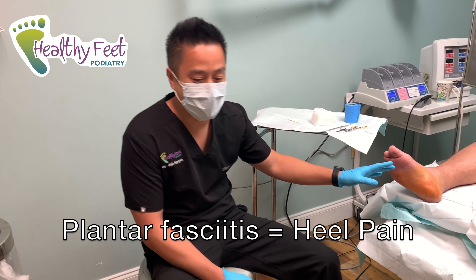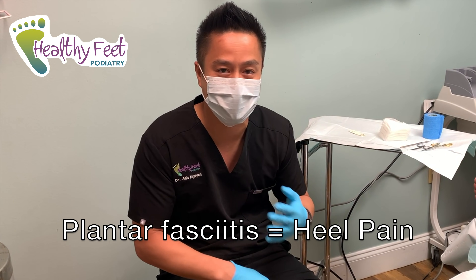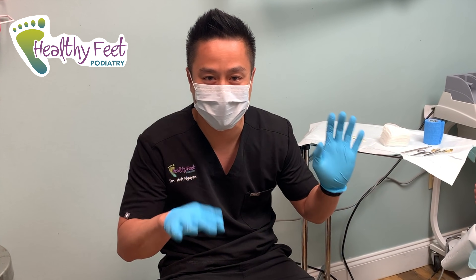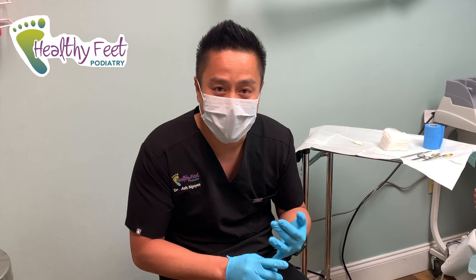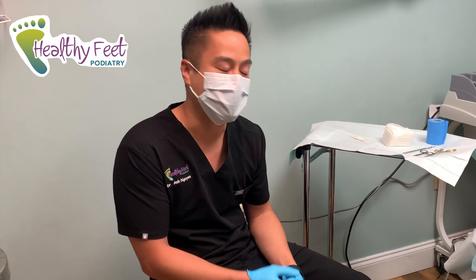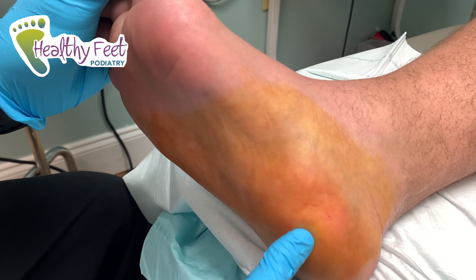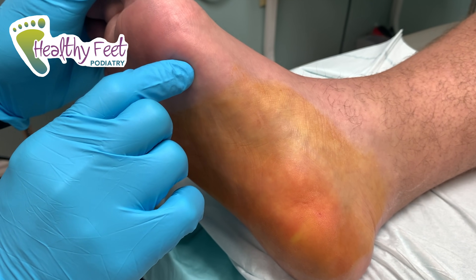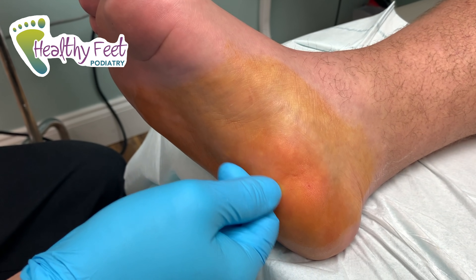Our patient here has plantar fasciitis and has tried everything — injections, stretching. His flexibility is better than it's ever been since he was a child, but he's still having pain. We're going to do a plantar fasciotomy today. The plantar fascia attaches to this part of the foot and goes all the way up, so when he steps down his arch flattens out, putting a big pull on the plantar fascia.